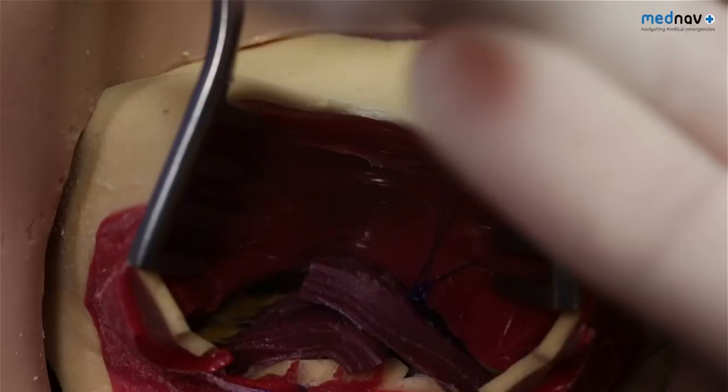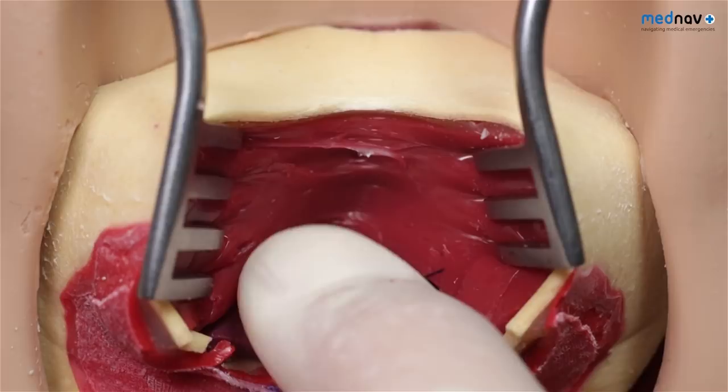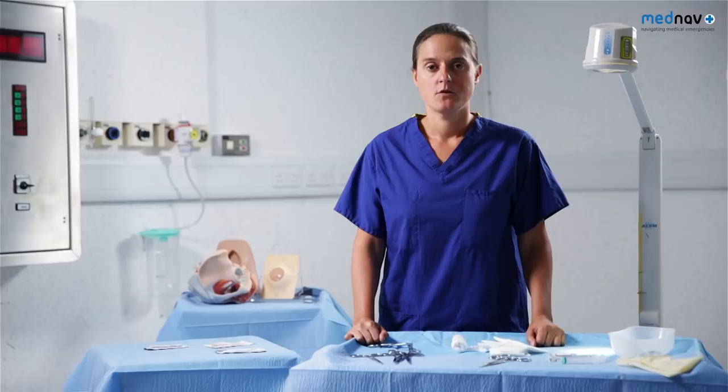Bury the surgical knots beneath the superficial muscles in order to prevent knot migration and pain. At the end of all perineal trauma repairs, a PR and PV must be performed to check for haemostasis and adequacy of the repair. For third and fourth degree tears, you will need to give a course of prophylactic antibiotics to reduce the risk of infection. She will need stool softeners for a week to reduce the risk of wound dehiscence.